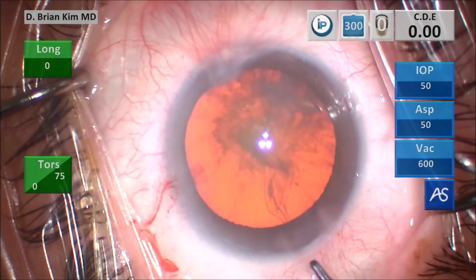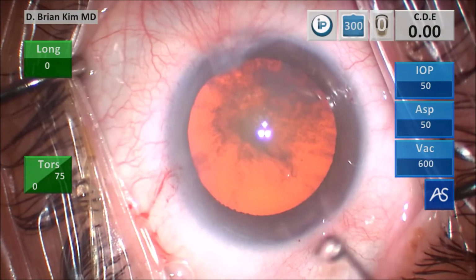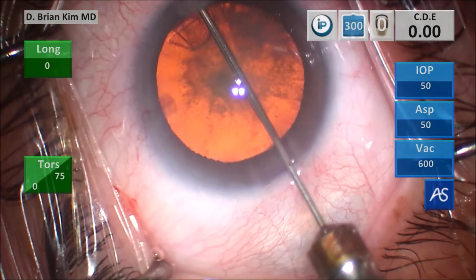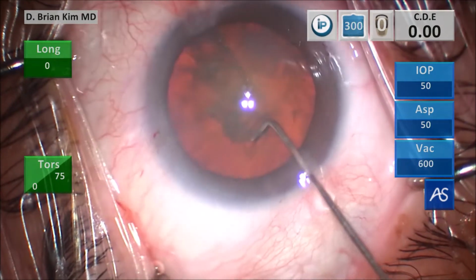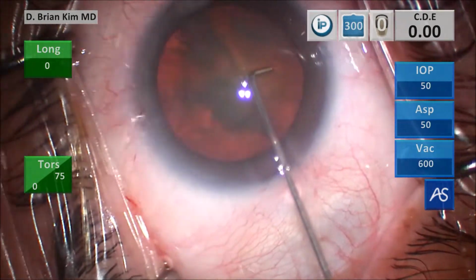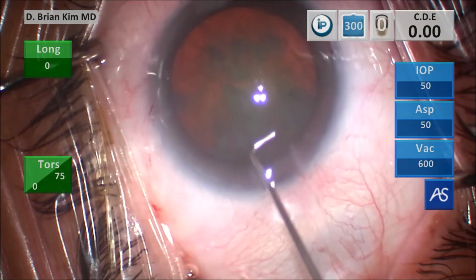Finish off the rexis, burp some viscoelastic out, and this is the capsular fornix hydrodissection technique. I place a cannula under the rexis edge contra-incisionally, rotate the cannula tip down towards the nerve, get a nice wave, decompress on the left side, sweeping under the rexis edge on the left side, pushing BSS at the same time, doing the same thing on the right side, and the lens begins to spin.